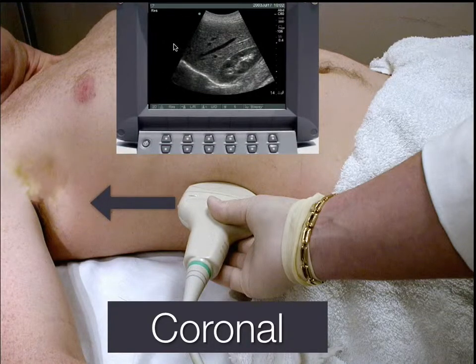This is still towards the patient's head. This is still towards the patient's feet, just like a sagittal plane, but because we're coming from the side of the body, the skin line is now lateral, and this is medial going in here. Okay, this is towards the spine, if you will.